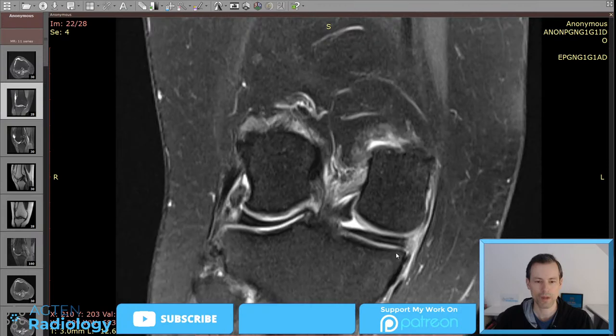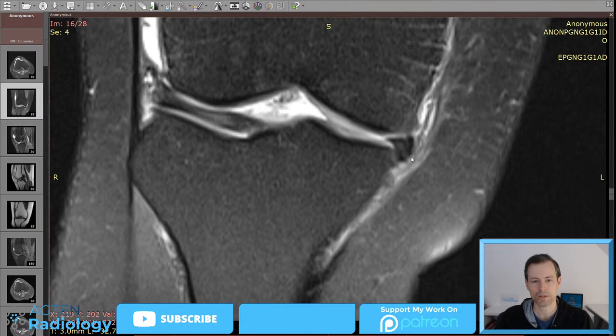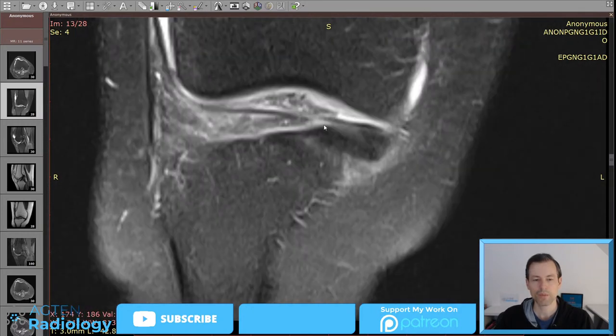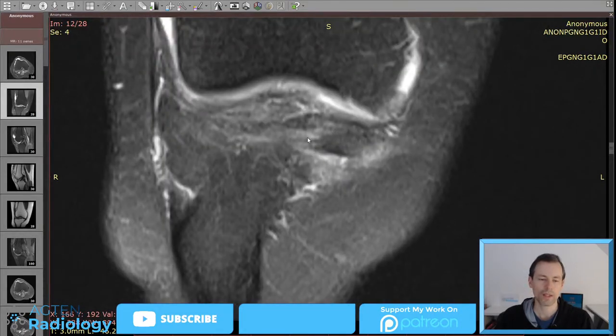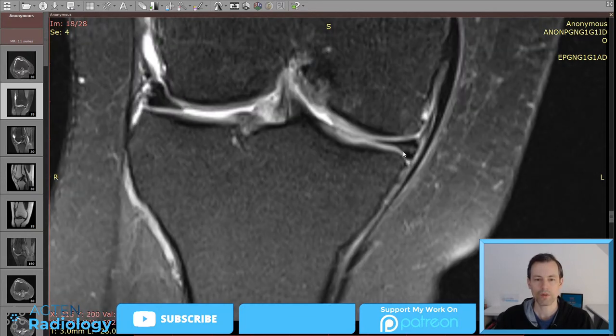Remember, we're on the medial side. So we are coming from the posterior portion here, zooming in. So we already see some internal signal changes. And now we've got all this meniscus substance up here. It's quite unusual to have this meniscus flipping or hanging over this anterior portion. Most of the time it's happening at the meniscotibial gutter, where you have tiny meniscus flaps or bits here, and they're also frequently missed. So really make sure you check for any kind of meniscus substance down here.